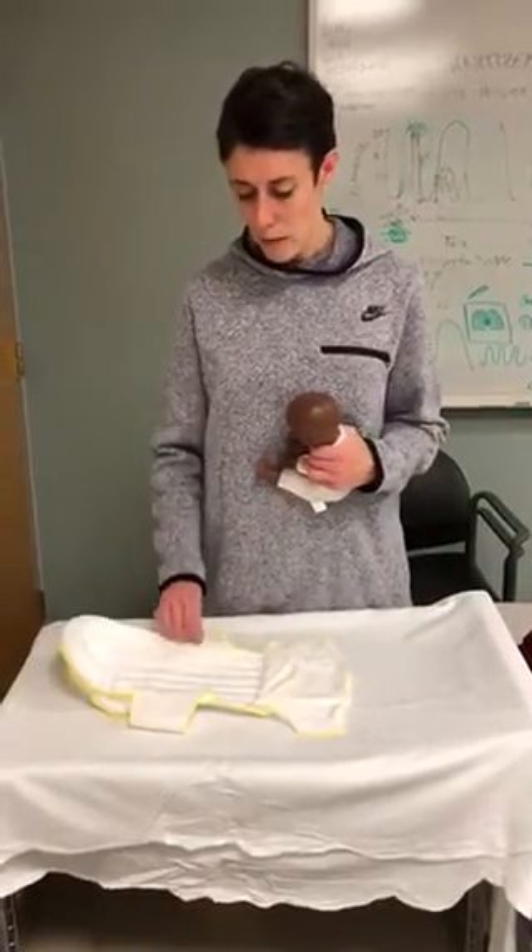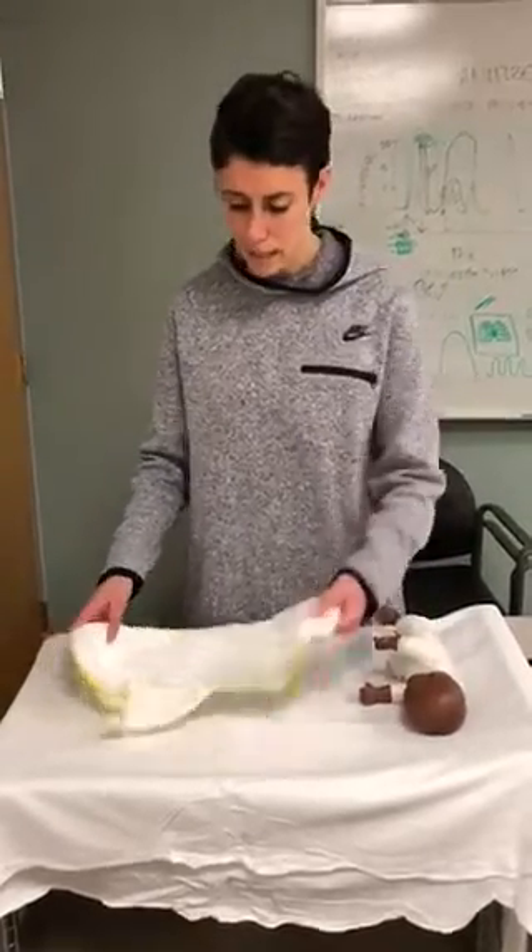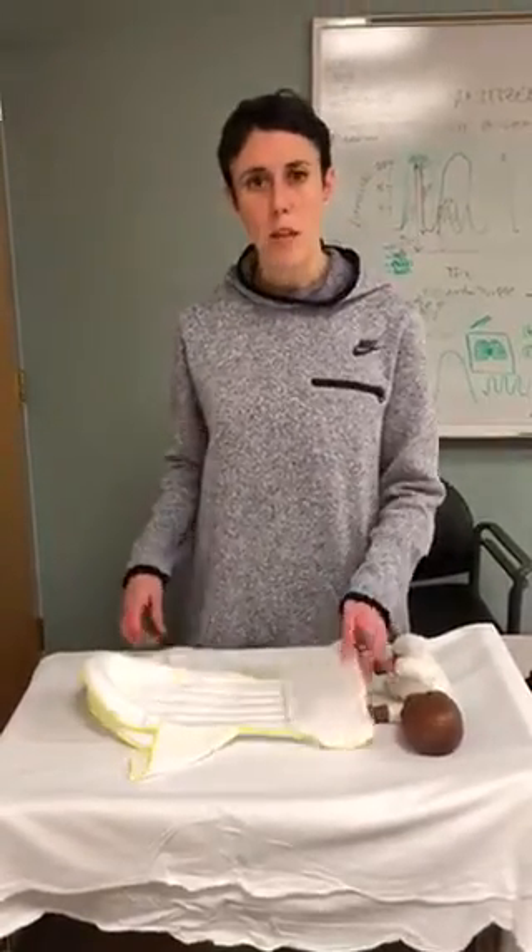We're going to talk about the last new product we're going to have out on the floor. This is the Dandelru Light. This is meant for babies that are under the lights.